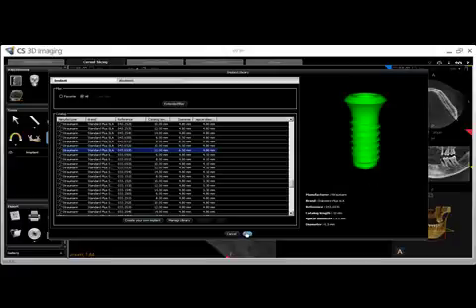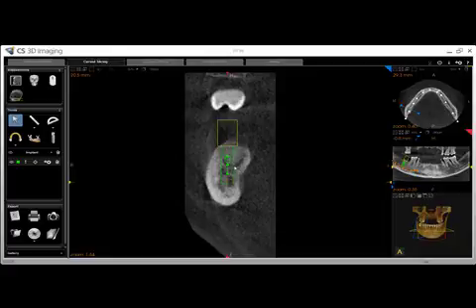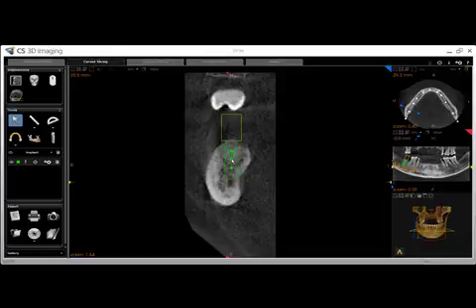The implant will be placed into your cross-sectional view. You will see the body of the implant as well as a yellow cone for restorative projection. For manipulation of the implant, there are three movement handles — the one in the middle is for bodily movement. Left-click and hold to move the implant into position. There are also handles for apical rotation and occlusal rotation.